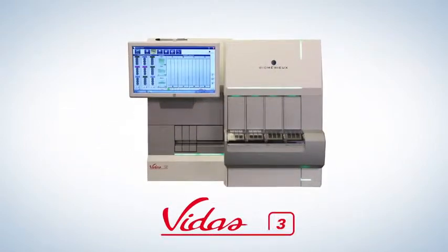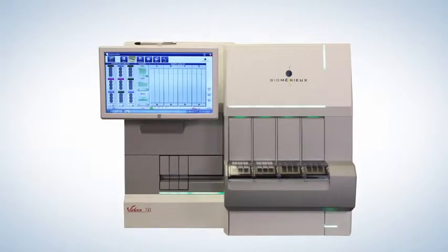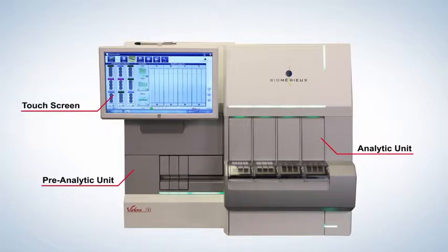Welcome to VIDAS 3. There are 4 key components to the VIDAS 3. The pre-analytic unit, which can hold up to 27 samples, the analytic unit, with a capacity to run up to 12 tests, touchscreen, with intuitive interface guiding the user through the workflow, and LED bars, giving a visual cue of the status of the different sections and overall analyzer.